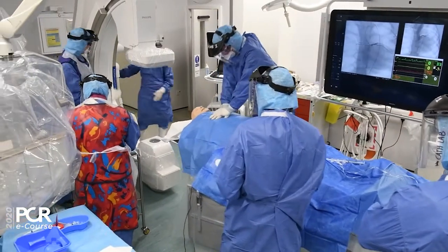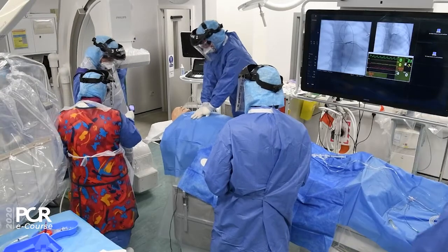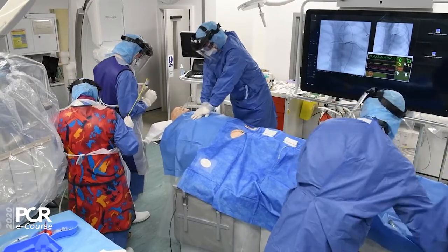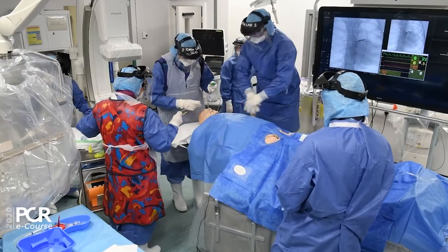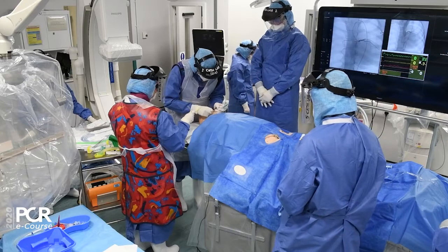Are you getting tired, Callum? Okay, can you angle it, please? 2 minutes over. Okay, let's take the table downwards as well. Give you some space. There you go. Stop CPR. Okay, stopping. Rhythm, still VF.